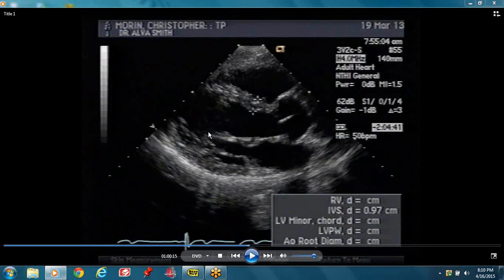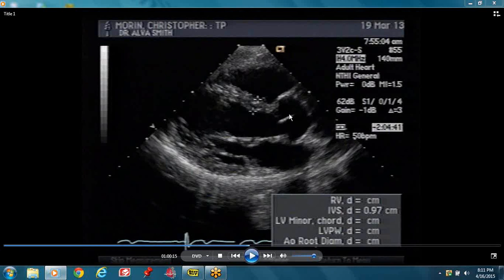The cords extend all the way down to the papillary muscles. You have two papillary muscles — the anterior lateral and your posterior medial. In the parasternal long axis view, you can see the aorta. The aortic valve is closed here and you can see it closed with a very thin line.